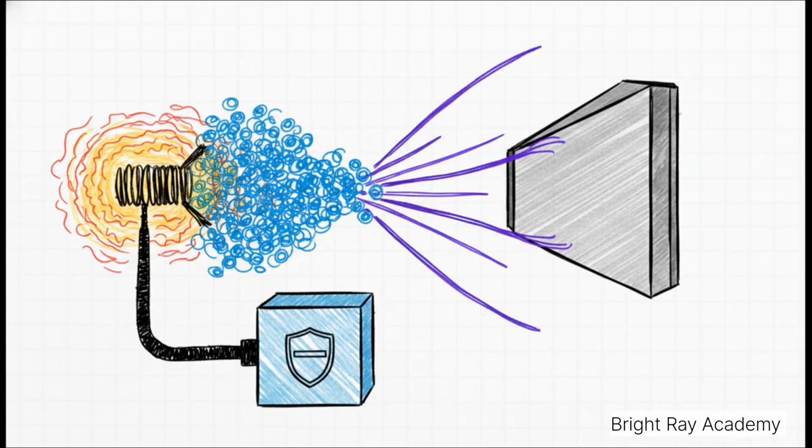Okay, but as perfectly separated as these circuits might seem, they actually interact in some pretty sneaky ways. Enter the space charge effect. Here's what happens. As you raise your kVp to get a more penetrating beam, the anode side of the tube becomes highly attractive. So much so that it actually starts pulling extra electrons across the tube that normally wouldn't have even had the energy to leave the immediate area of the filament. So raising your kVp accidentally increases your MA.